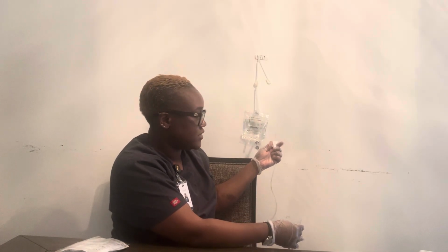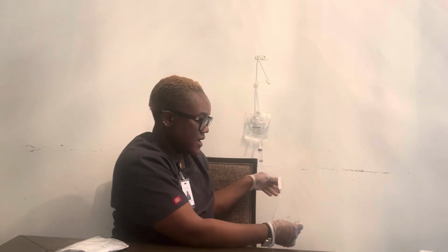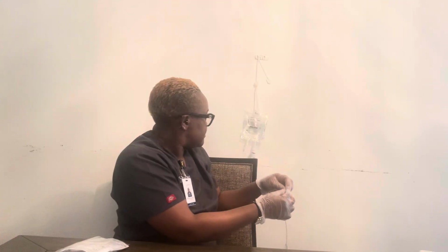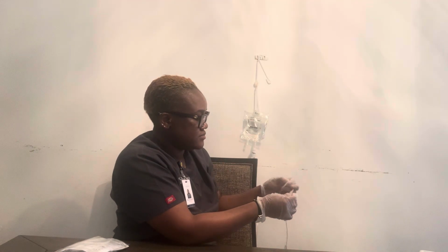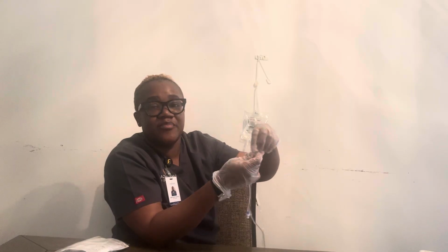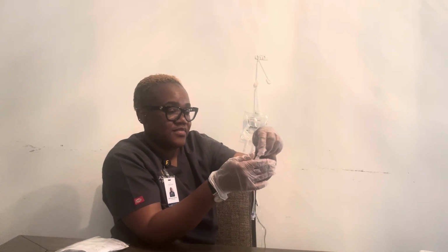Okay, next I'm gonna turn it off. I'm gonna close it, and I am gonna use my alcohol pad, and then I would clean my adapter end. And after I clean it, I would allow this to dry, and then this I would attach to the patient's IV site.